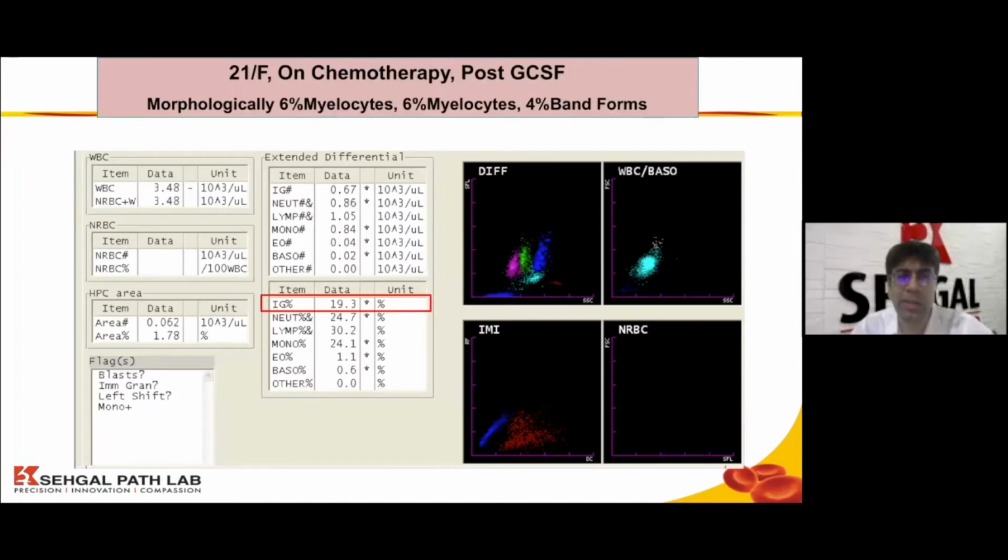Now, this is an example where the patient was on chemotherapy and was given growth factor therapy post chemo. Typically, post growth factor therapy, you see immature myeloid cells in the slide, and a flag which was raised here was immature grans and left shift. So if you see, there was a value given here for the immature grans of 19%. We reviewed the smear, and there were around 16% left shifted cells in this, which typically matches.